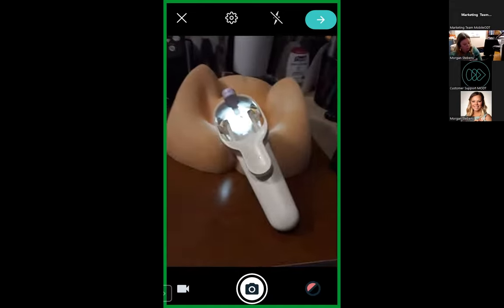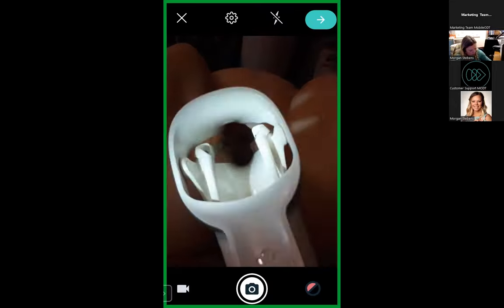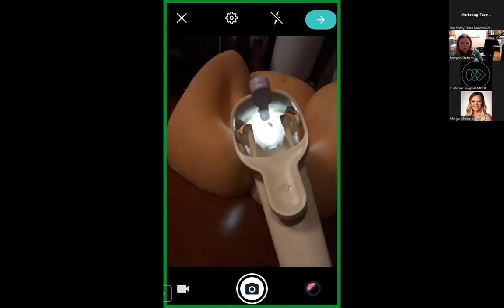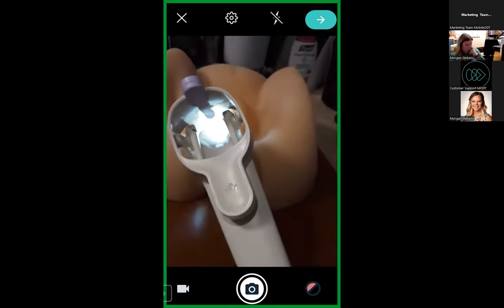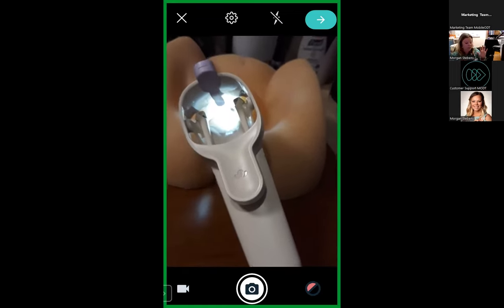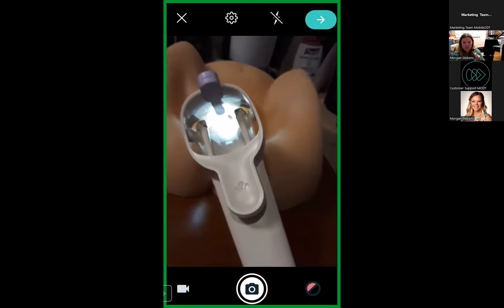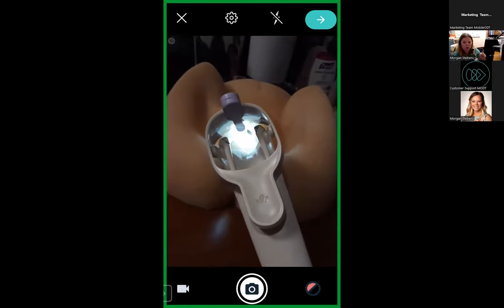So in this situation, right? Maybe we're not getting as good a light as we want, or the picture is not as good as we want. I'm gonna adjust my lighting. It's not as good. It's washed out. It's too much. And I want a good picture of the cervix. So really I'm gonna go to my colposcope mode, right? So this is for full body photography. If I was taking external genital photos because there's an injury, I would be utilizing this. But now we're gonna switch from the full body mode to the colposcope mode.